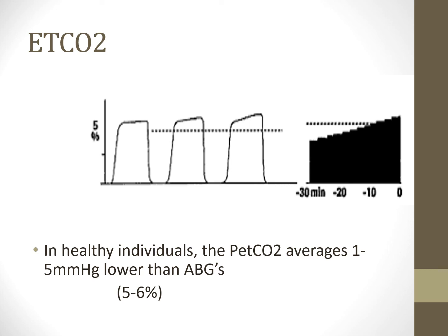I drew a blood gas. Her end-tidal was 19 at the time of the blood gas. I drew the blood gas, and her CO2 was 40. So her end-tidal was less than half of what her PaCO2 was. That's not normal. That's a huge dead space process. And her issue was she threw blood clots, right? So that's something that I like to look at there.